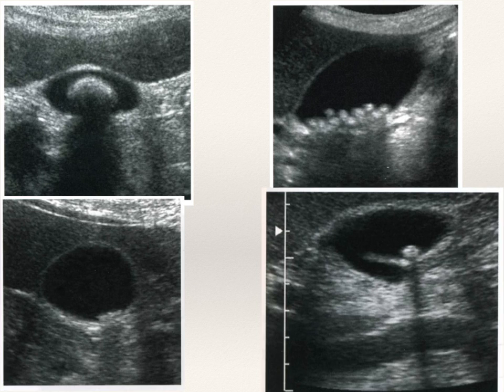Here are 4 examples of gallstones within the gallbladder. I want you to take a moment, pause the video, and identify all of them before moving on. Okay, so I'm assuming you took a moment to pause and find them all. Here they are, pointing with the arrows in all of the situations. Again, you can see that their shadowings can look a little different based on the size that they are. I also want to point out in the image on the lower right side of the screen, the stone is actually sitting on a junctional fold of the gallbladder. So at some point this gallbladder is somewhat folded around itself.